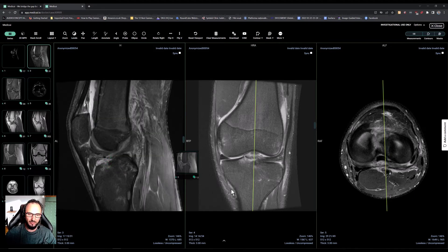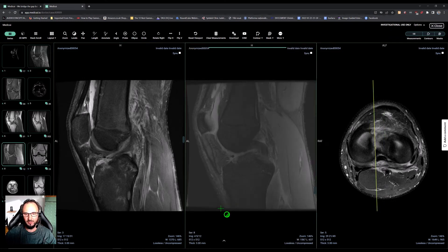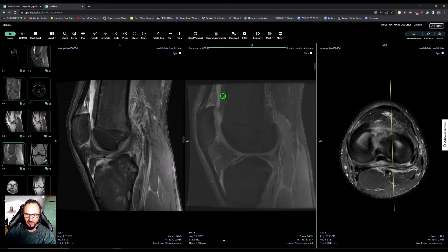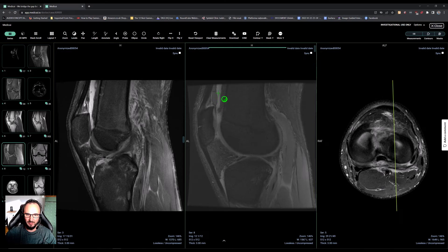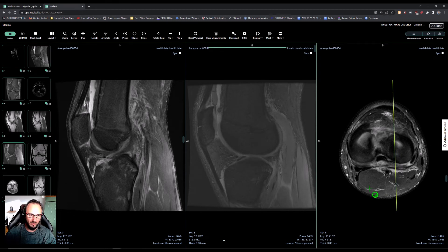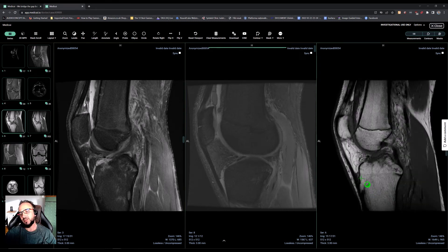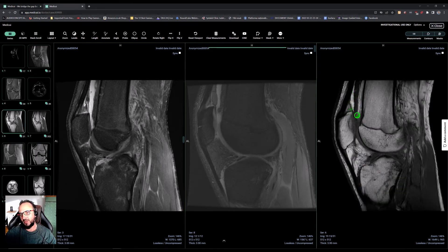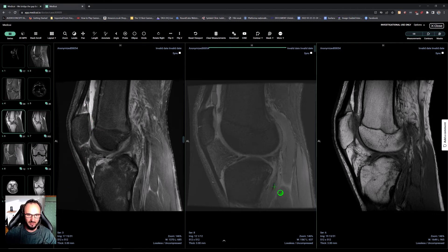Usually fat means fracture. You can see some fat on this gradient sequence. The T1 really shows us that this is fat — it is hyperintense on T1, saturates on fat sat sequences, and on gradient sequences it is isosignal with subcutaneous fat.